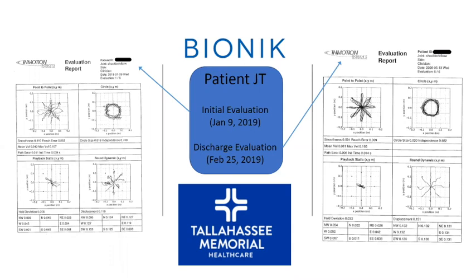So it's not somebody who is going to be changing protocols or modifying anything. But the secret we know to improvement with motion is repetition, repetition, repetition. And how do we get that if we have limited time? The answer is we get creative. And so in this case, their way of getting creative was to have additional after hours time available on the robotics device that someone who is not getting paid large sums of money could actually provide that service to the patients.